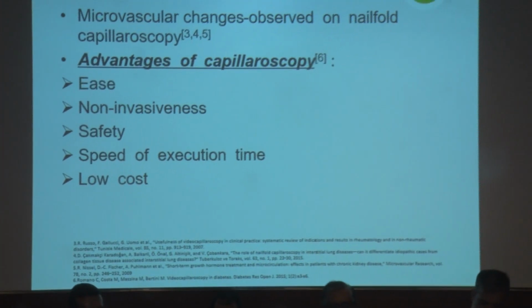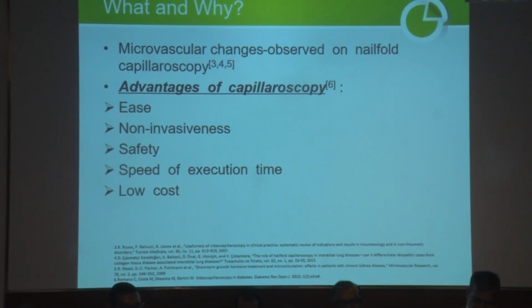The gold standard approach for screening is always regular dilated fundoscopy examinations, but in rural areas of India, the referral to ophthalmologist and screening is poor. So here I'm using a technique called nail fold capillaroscopy.